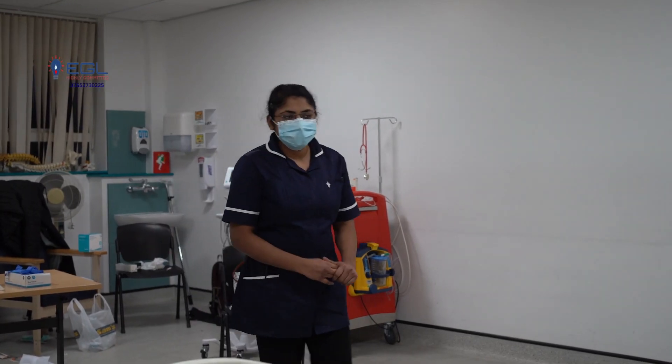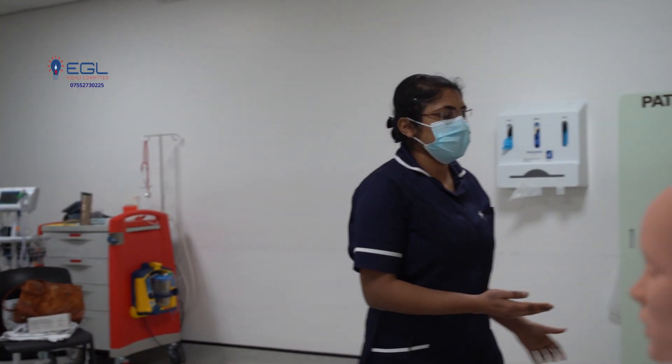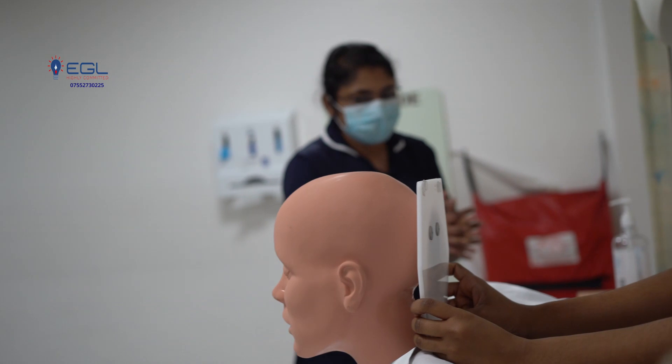As I enter into the room, I check for room safety. The room is safe for me to approach. I gel my hands according to WHO guidelines.